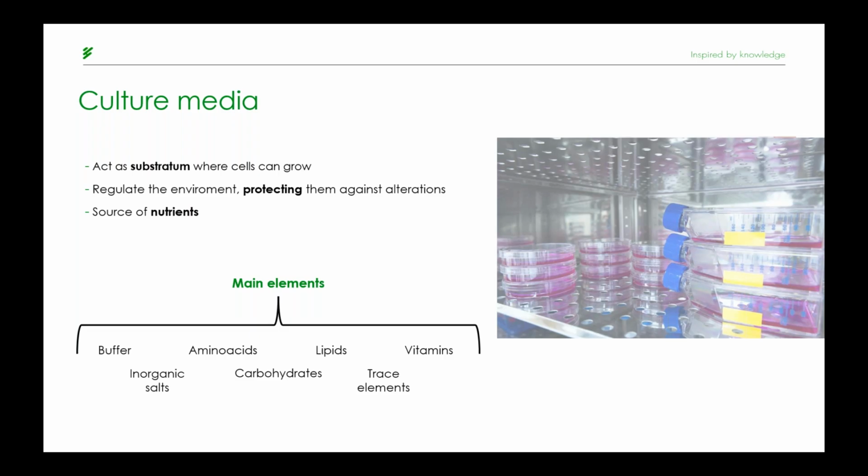Firstly, the buffer, for example sodium bicarbonate, which regulates the pH of the solution. Inorganic salts like sodium, calcium, or even potassium. These ions are essential for the membrane electric potential.